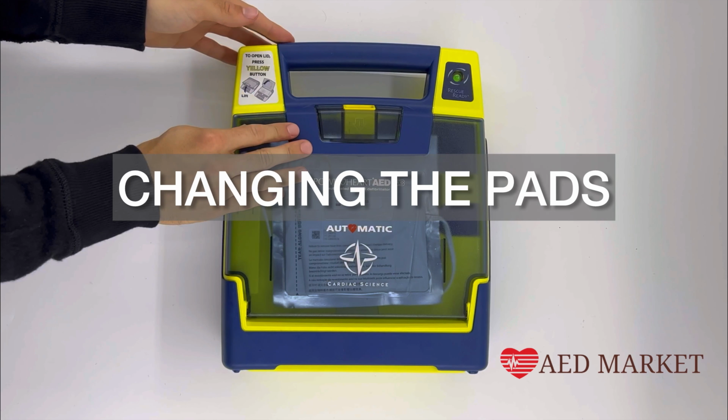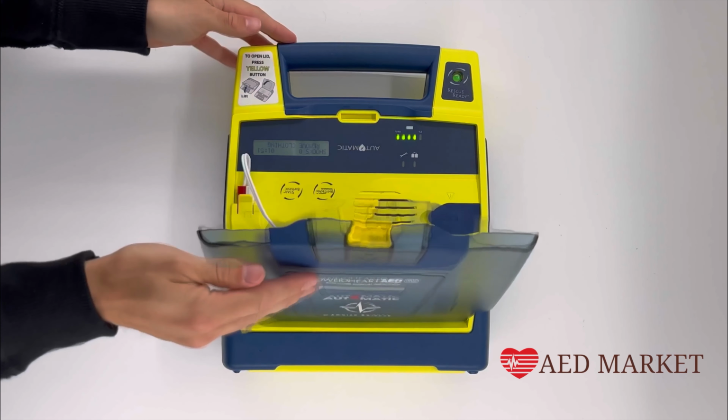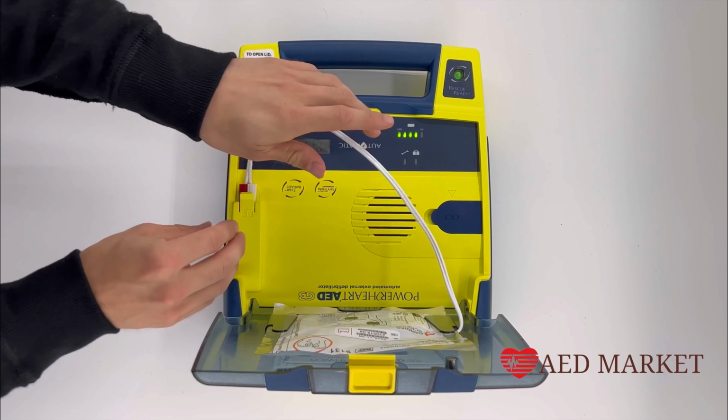For the sake of clarity in this instructional video, we temporarily removed the battery, although in normal circumstances, it should remain in place. To replace the pads, press the designated button and open the lid. Disconnect the old pads and you'll be ready to install a new set.